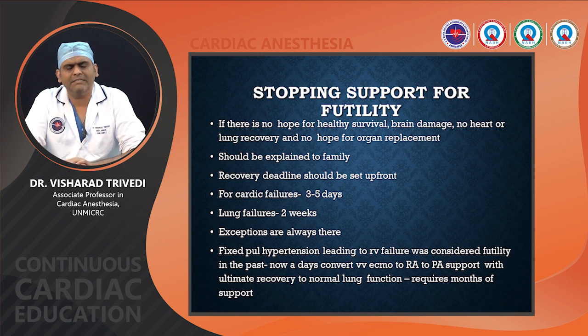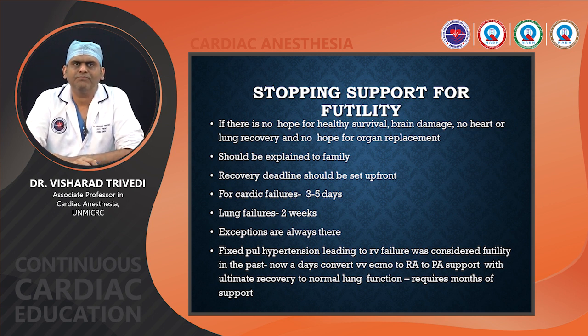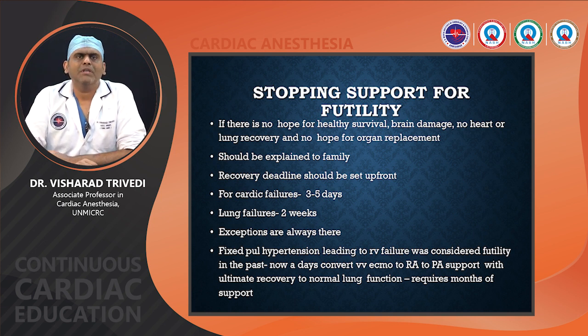Mostly for cardiac failures it is around 3 to 5 days, for lung failure it is around 15 days. But of course exceptions are always there, as you have seen in COVID also. Many patients have come off ECMO after 100 days also. But you have to set a recovery deadline upfront, so that if after that deadline the patient has no signs of any recovery, then you have to explain to the family and stop the supports for futility.